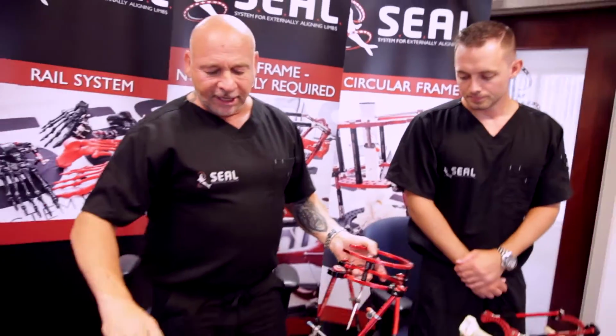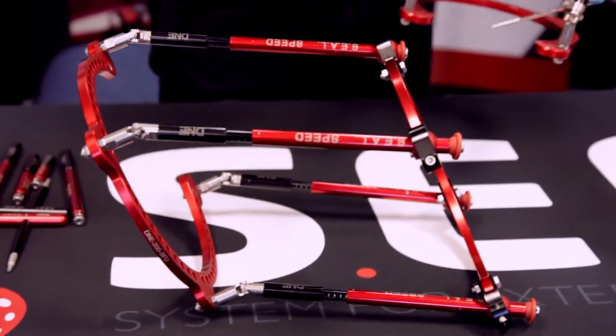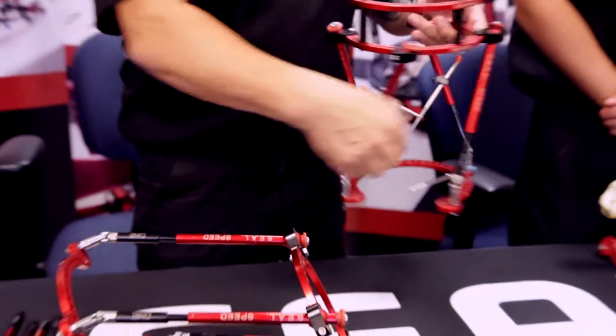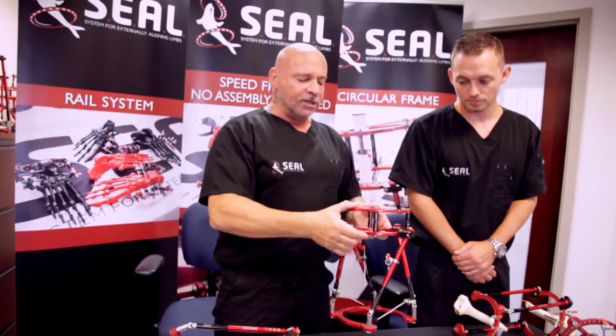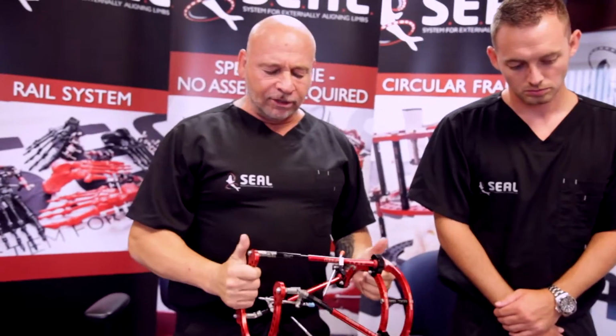What you also can do is, anywhere along these rails, you can throw our pin collets and throw any size pin you want at any angle to grab fragments, to have more purchase in the bone so it's stronger, however you want to do it.